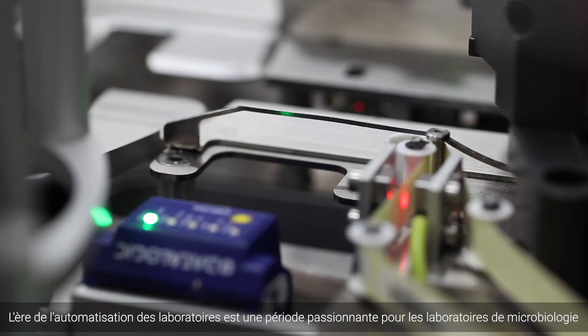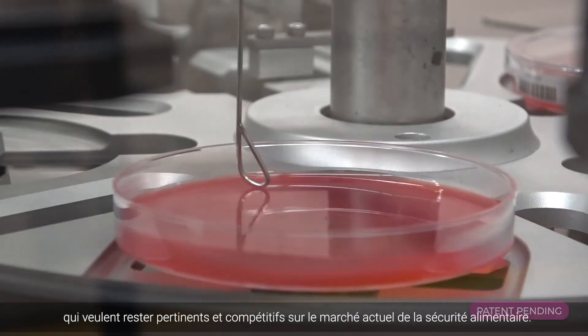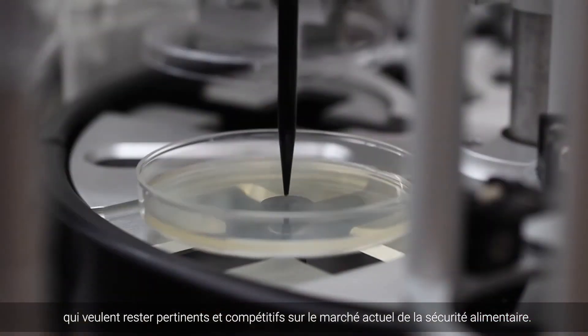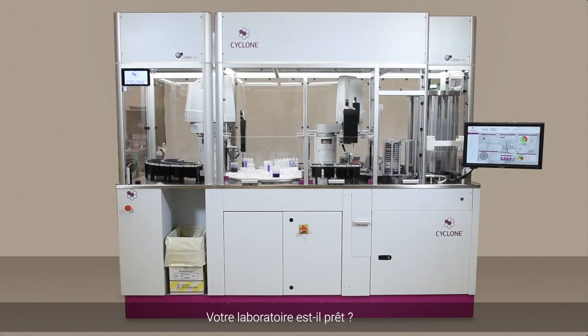The age of laboratory automation is an exciting time for microbiology laboratories that want to stay relevant and competitive in today's food safety market. Is your laboratory ready?